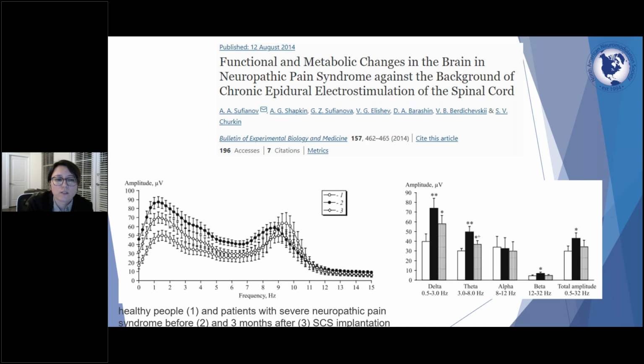The major findings are that the neuropathic pain group before SCS showed a pretty strong theta band activity. When they are under SCS treatment in the 3 months window, the activity in alpha range is switching from low frequencies to the high frequencies. And another finding is that the healthy control shows pretty strong fast alpha rhythms in the spectrum. Right-hand side also showing similar information.